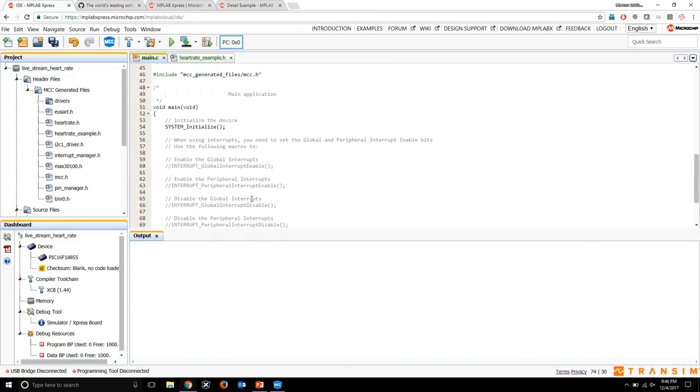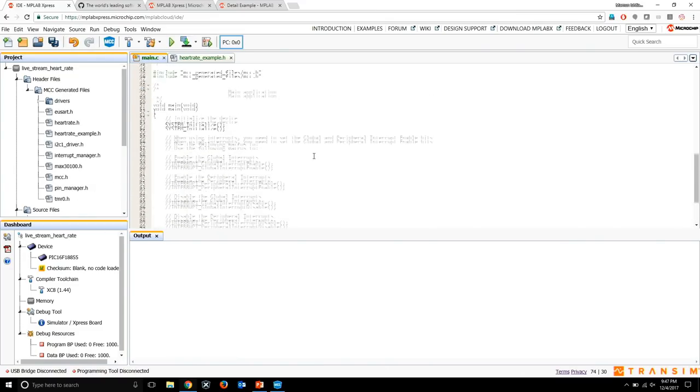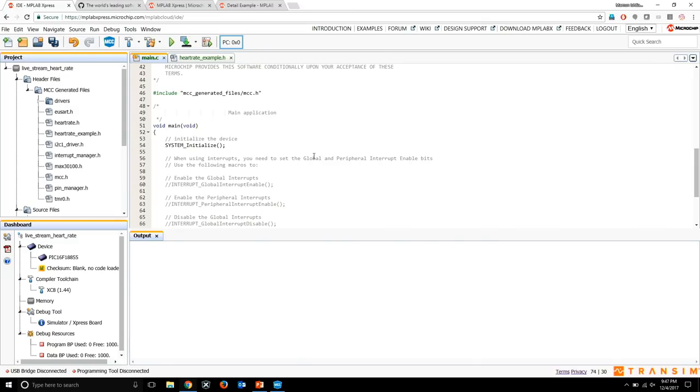But there are a couple of things you have to do here, and you should pay attention to this, because it's maybe not very intuitive, but it's something you have to do to take advantage of the code being generated from MCC. So to use this function, main.c is a template that MCC created for us. But it does not know what files you're going to use, especially for the examples. So I'm just going to have to include the example file.